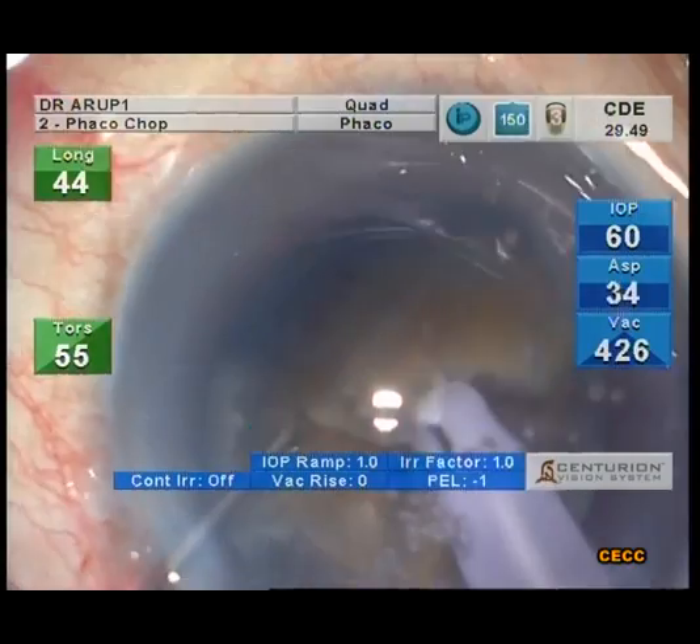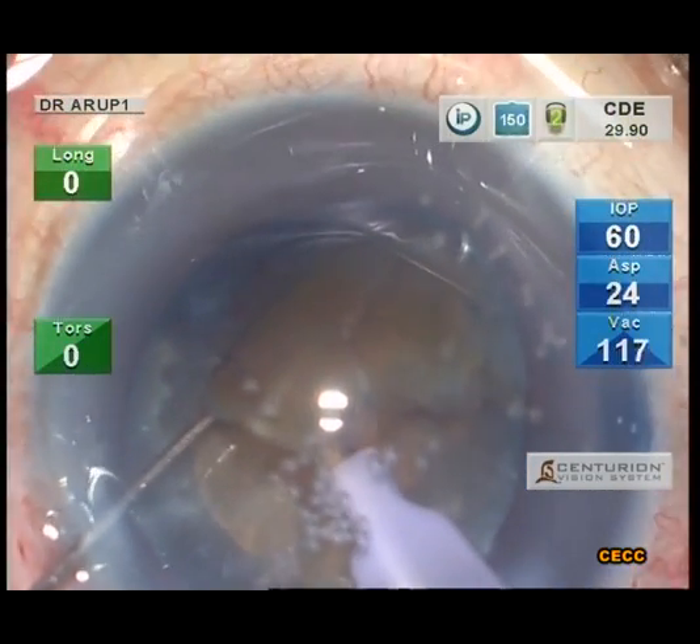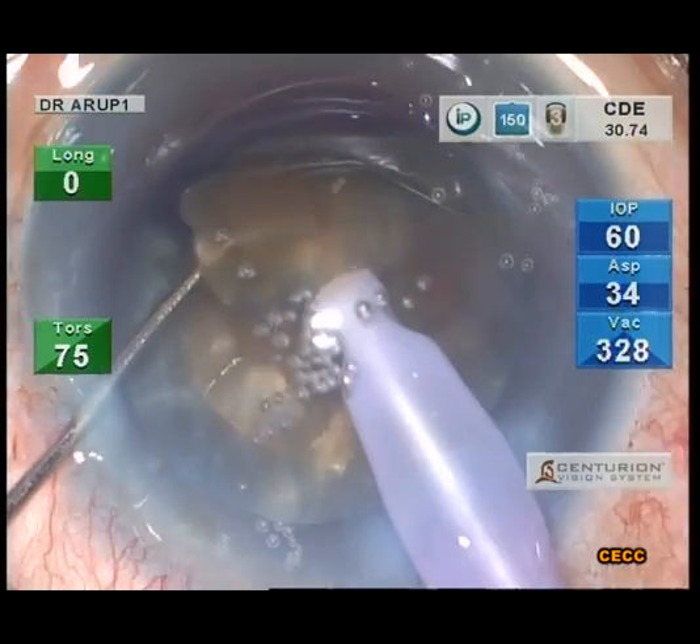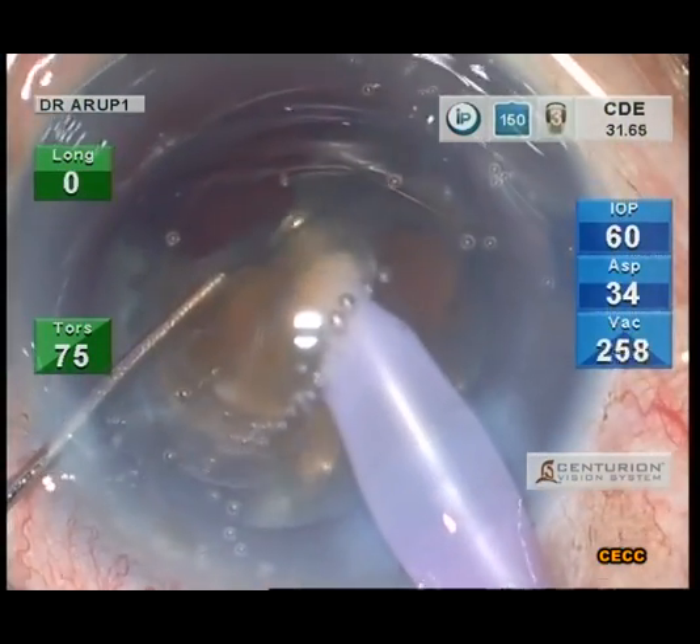The nuclear fragments are then consumed. It is desirable to have the nucleus downsized into multiple pieces. Harder and larger the nucleus, smaller the pieces should be.